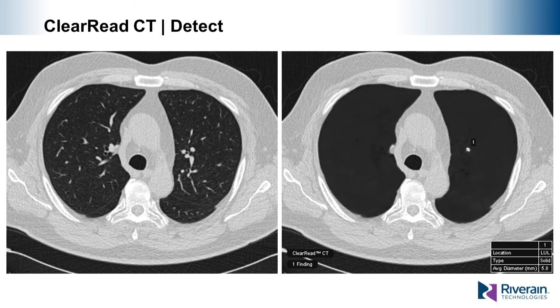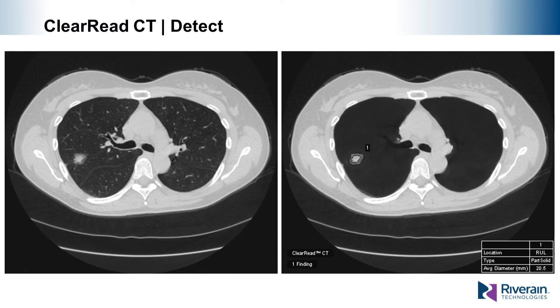ClearRead CT Detect builds on vessel suppression, providing automatic nodule detection and segmentation. The nodule is segmented in three dimensions, providing volume measurements as well as linear measurements in the axial plane, the location of the nodule within the exam, and the type of nodule: solid, part solid, or ground glass. In the case of a part-solid nodule, ClearRead CT Detect will provide measurements of not only the entire nodule but the solid component as well. These measurements are displayed in detail on a summary report page.